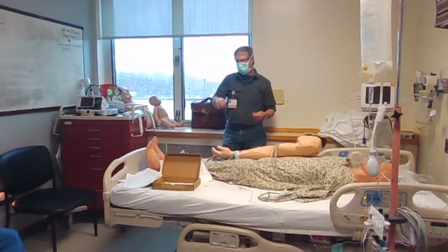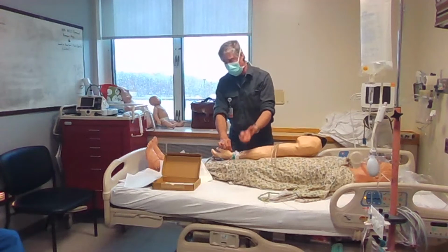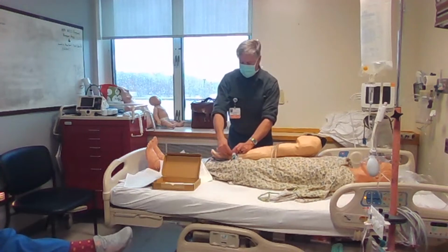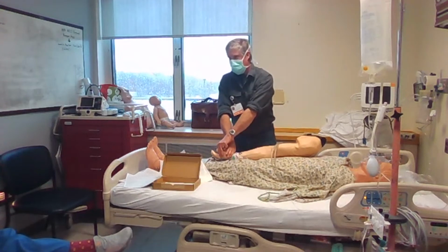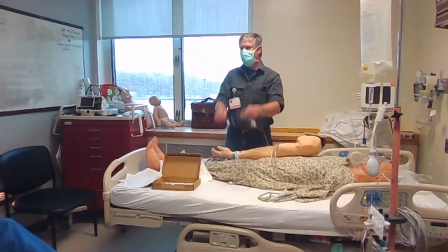So yeah, I didn't mention that, but you would typically suture it in. A lot of times in a really emergent situation, you're just going to slap something over it and make sure it doesn't get pulled. Another thing I typically do, when you put your occlusive dressing on, and you would have it sutured in if it were a case where they're going to be in the ICU, is take the tubing and wrap it around the thumb, bring it back like this and tape it across here so it's secured. Then you've got all this extra slack, so if it gets pulled, it'll come off here before it comes out there. That's a really nice way to tie it up, and it kind of naturally happens because there's a little fold.